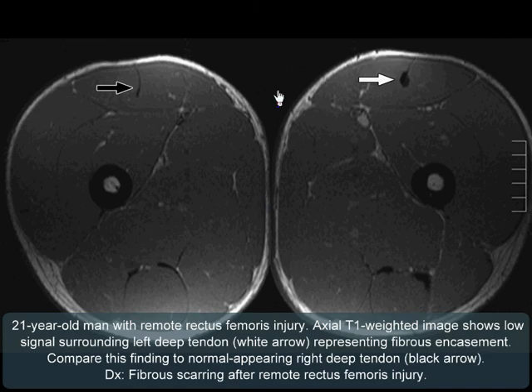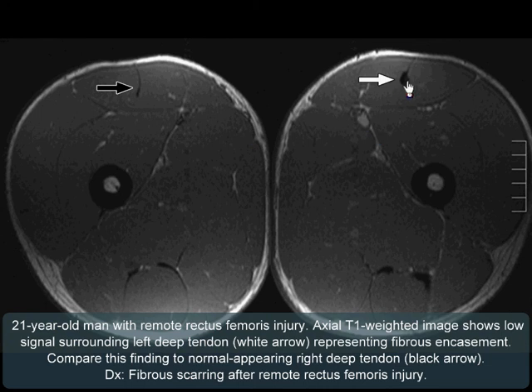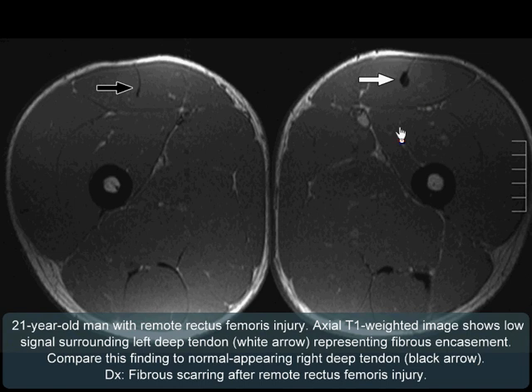This is a 21 year old man with remote injury. Axial T1 weighted image shows thickening and low signal surrounding the left deep tendon of rectus femoris, representing fibrous encasement. Compare this with the normal appearing right deep tendon. The findings are consistent with fibrous scarring after remote rectus femoris injury.